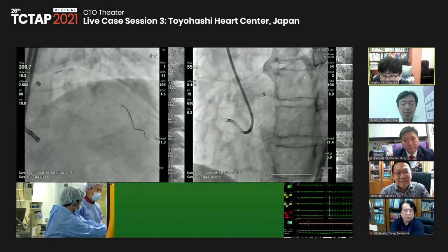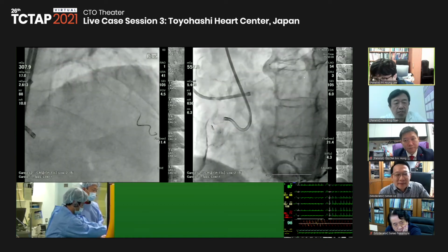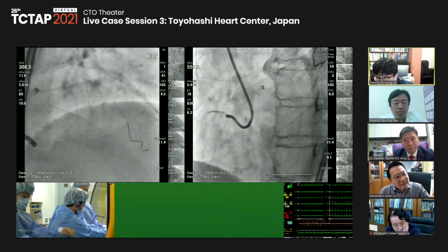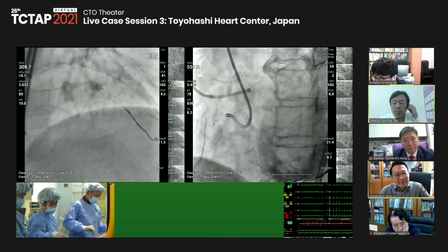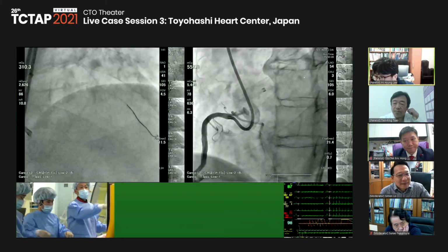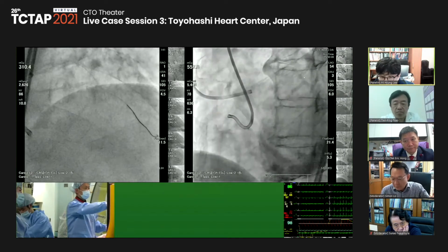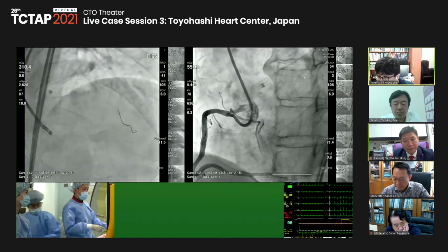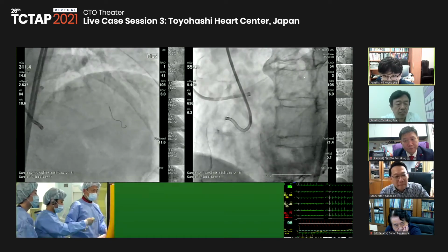Well, I think the most advantage of this CTO case is that we have a previous angiogram of the LAD, so that's a very big benefit in almost all cases of CTO. So we know the route, we know the distal target, we know the distal vessel size.